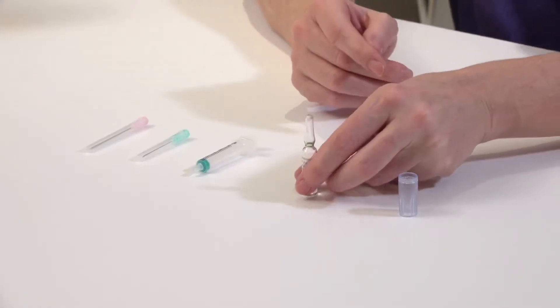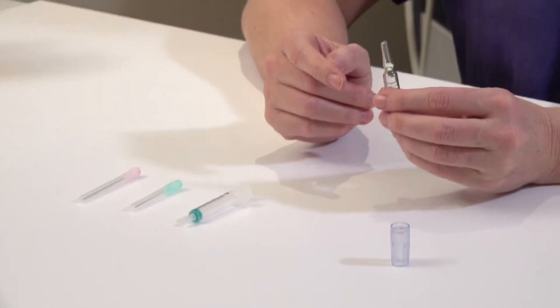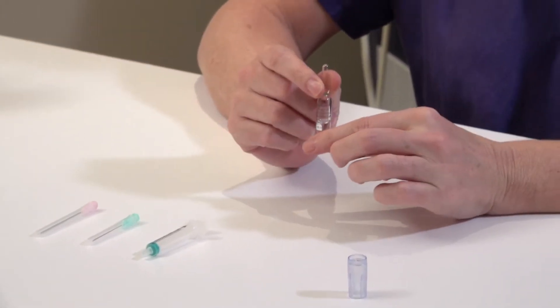I'm going to show you how to prepare and administer Prontogest. Prontogest is an IM injection and it comes in a glass ampoule.